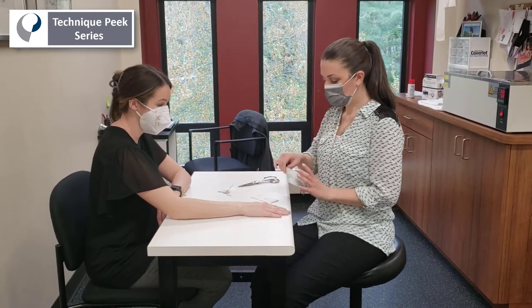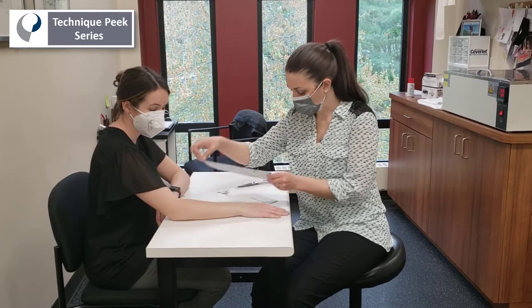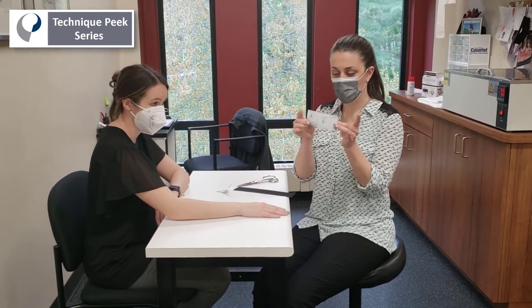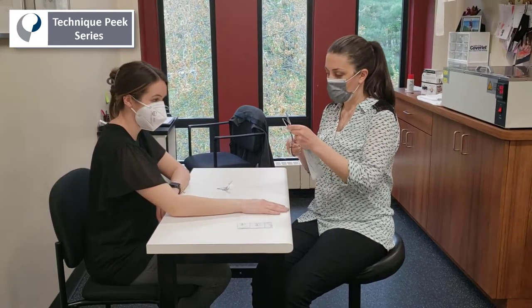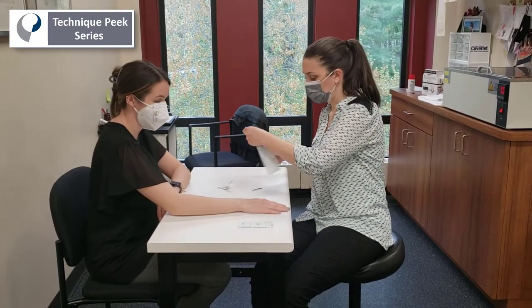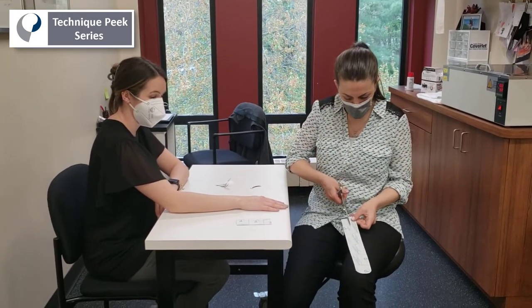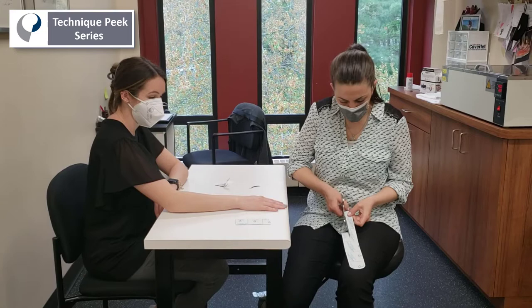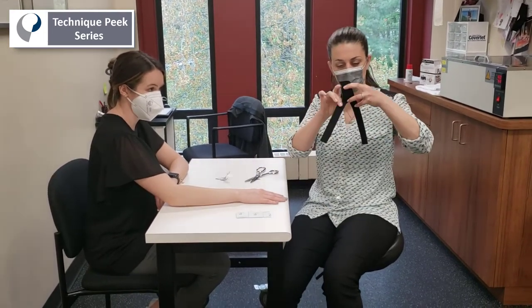We're going to take two pieces of tape about the length of the forearm, a little bit longer, and then another short piece about two or three squares in length. I like to round the edges because they stick better that way. Then we're going to cut it in half until about two squares from the end, so we're making a Y-shape.